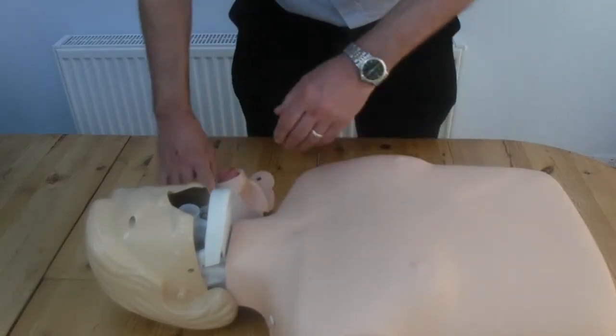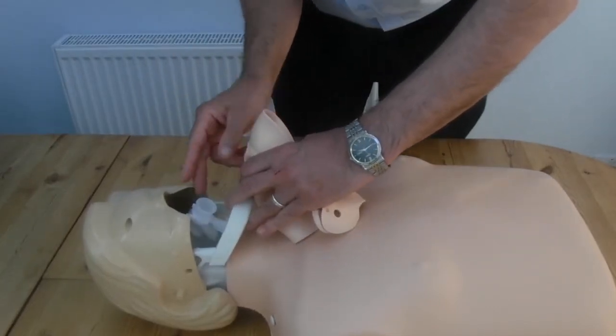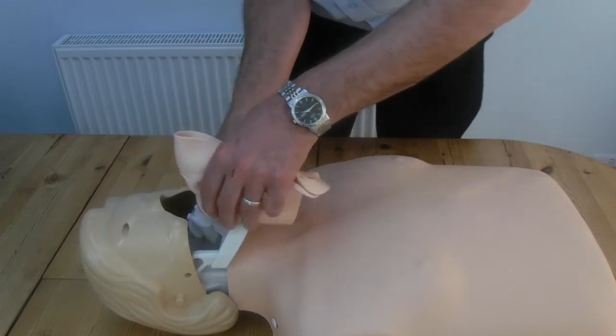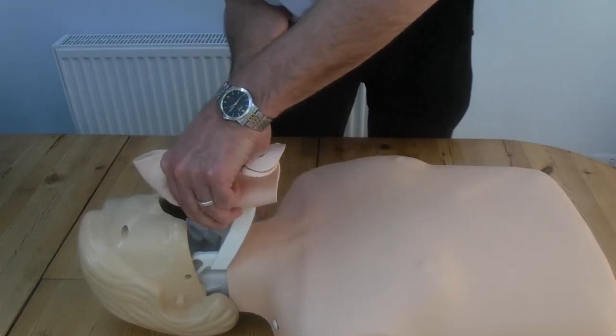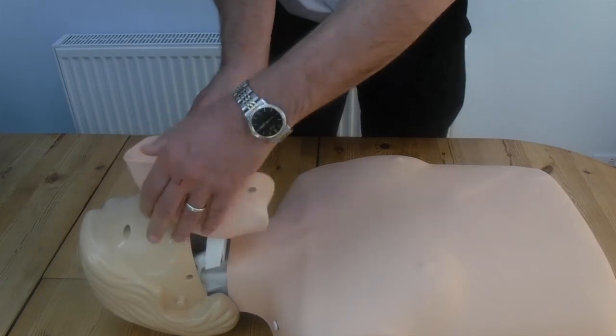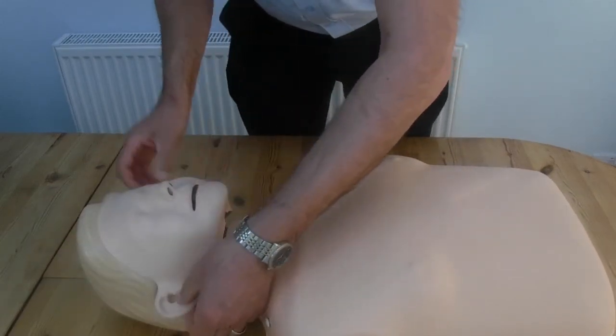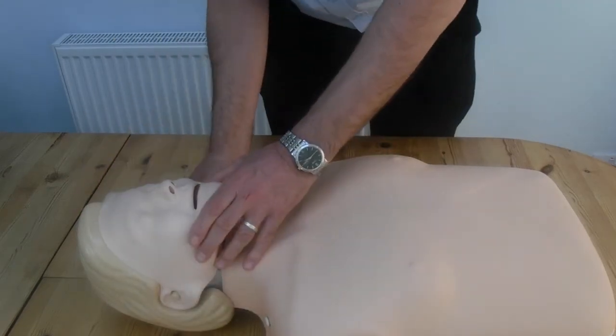Now that we've come to the face, if you've got thin fingers, just get in behind. Support the airway as you push the mouthpiece onto the airway — you hear the little click. It's attached firmly, and now just peel the skin back over the face and secure it up around the ears.